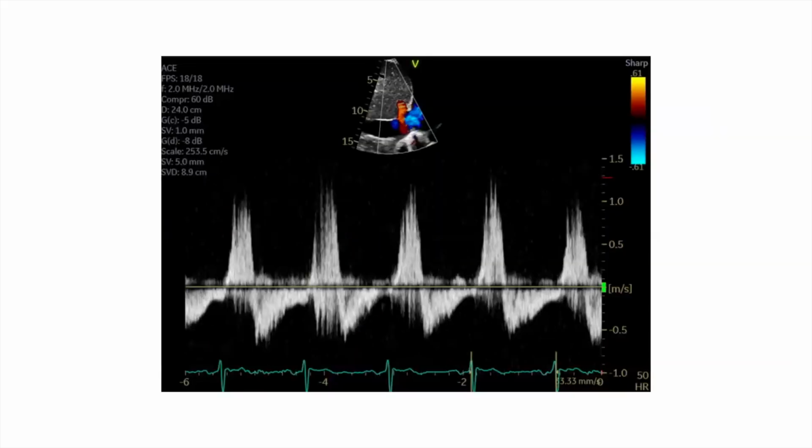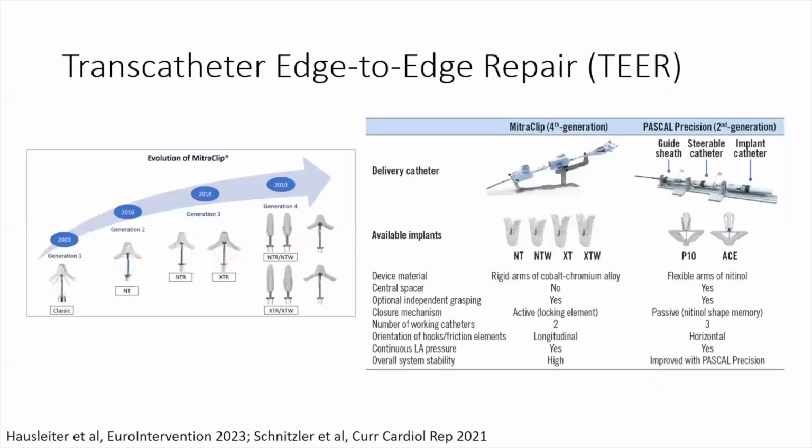And then if we look now at the hepatic vein, it's obviously having systolic reversal, which is suggestive of recurrent severe tricuspid regurgitation. And so this demonstrates a case of what we call single leaflet device attachment, which we'll go into a little bit more.